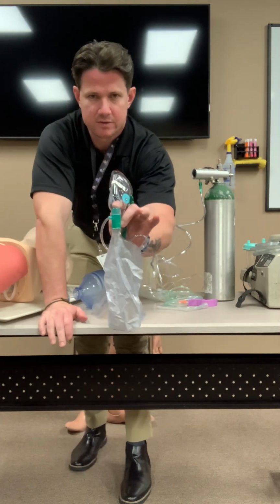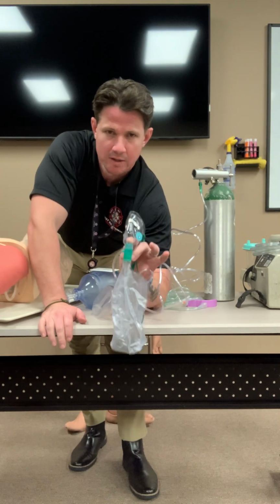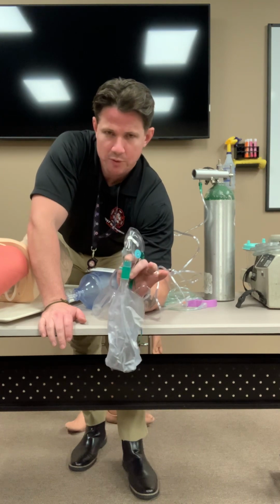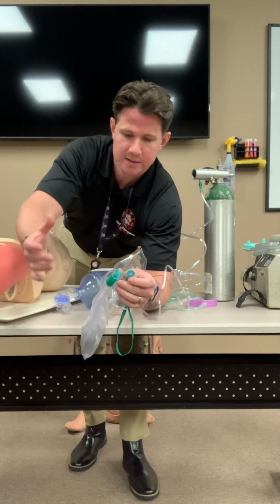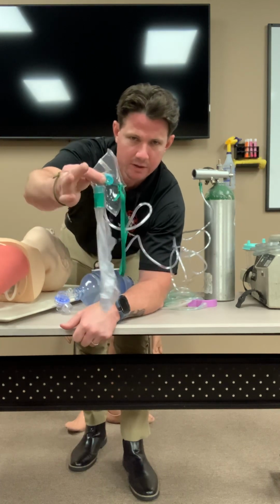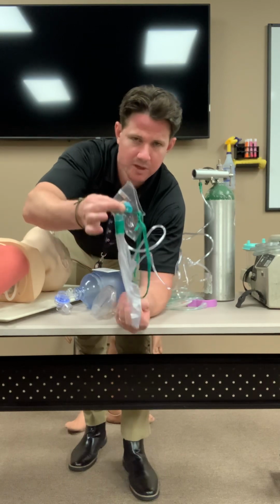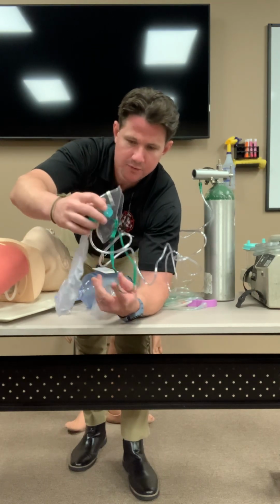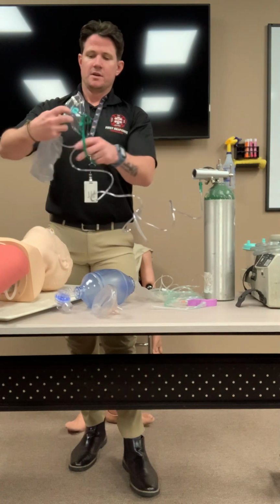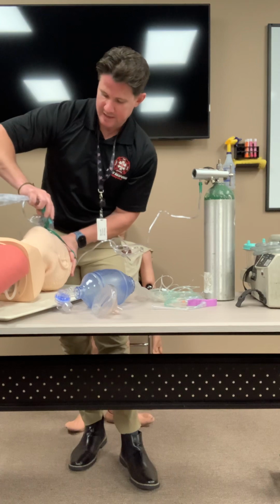You're gonna verbalize this, right? There's not actually oxygen here, so you're gonna verbalize, I am going to fill up the reservoir bag by covering the port with a gloved finger, right? If you do not do it that way, you can also verbalize, I'm going to fill up the reservoir bag, and I'm just gonna pinch the nose cup from the outside with a gloved hand, occluding the bag, so that backflow fills up the bag. Once the bag is full, we are now ready to apply our non-rebreather, okay? So, here's our strap. It's going to wrap around the back of the patient's head.